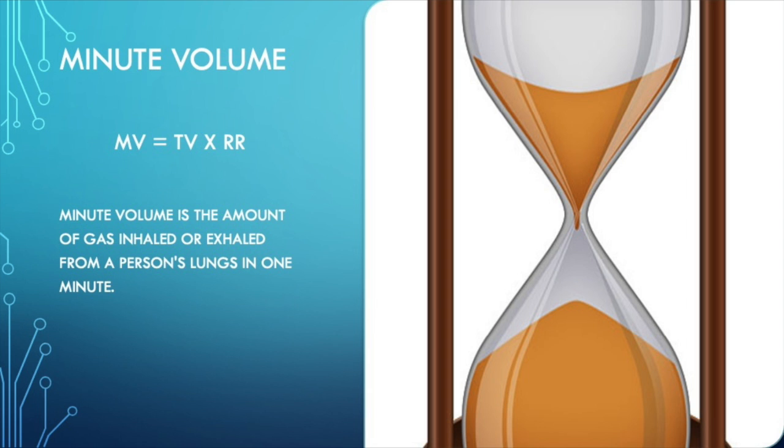Each breath generates a tidal volume at a set rate, the product of which is minute volume. Carbon dioxide levels in the blood generally vary inversely with minute volume. For example, a person with increased minute volume due to hyperventilation should demonstrate a lower blood carbon dioxide level. The human body will alter minute volume in an attempt to maintain physiologic homeostasis. A normal minute volume while resting for a normal individual is about 5 to 8 liters per minute, and that generally decreases when at rest and increases with exercise.